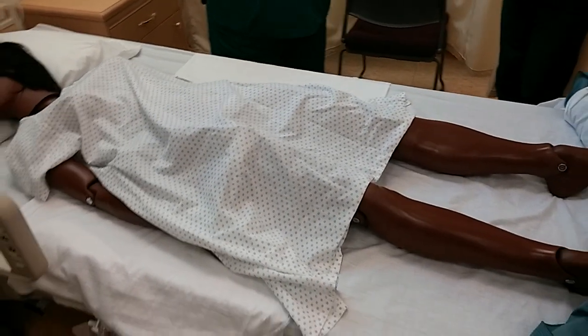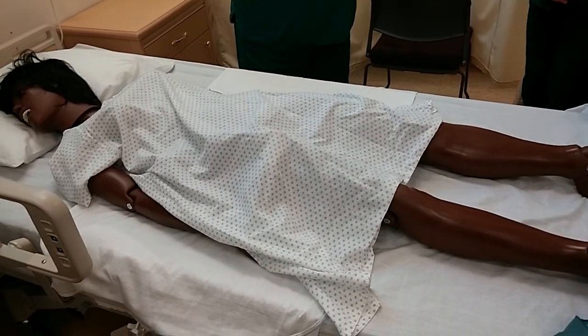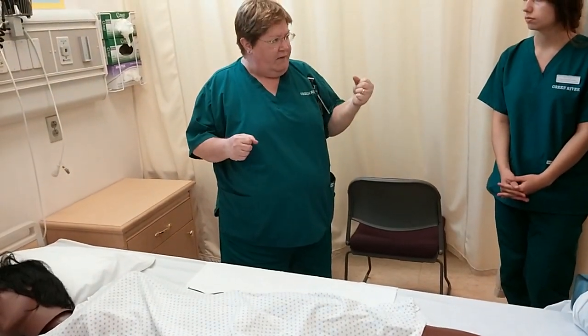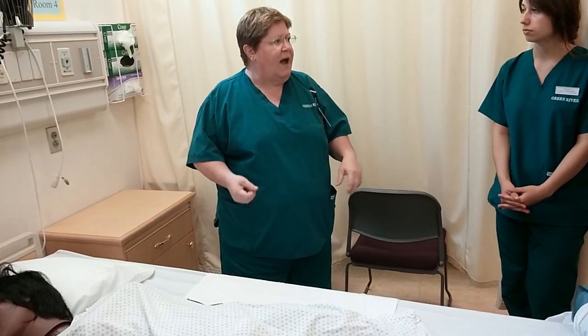As far as height of the bed when you're doing it, you kind of have to go between — if you've got a tall person and a short person, the tall person might have to stoop a little bit and the short person might have to lift a little higher.